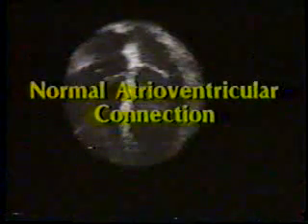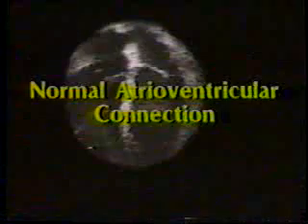Let us now observe normal crux anatomy in real time. This is the four-chamber view with the mitral valve in this position and lower insertion of the septal tricuspid leaflet here, morphologic right ventricle and morphologic left ventricle.